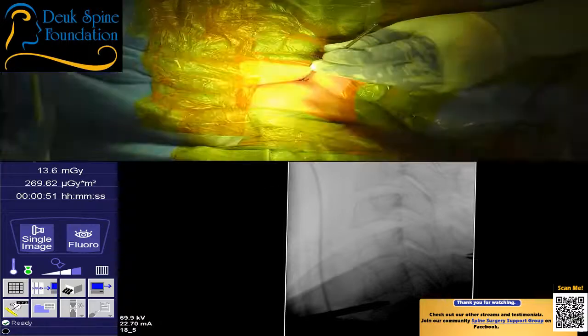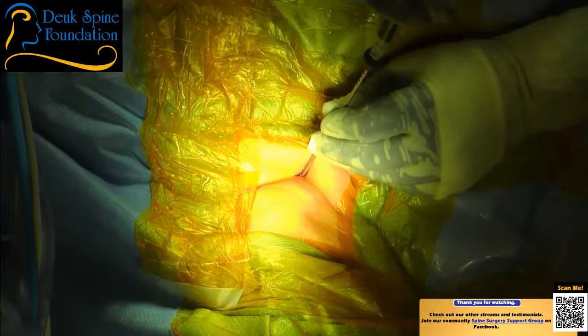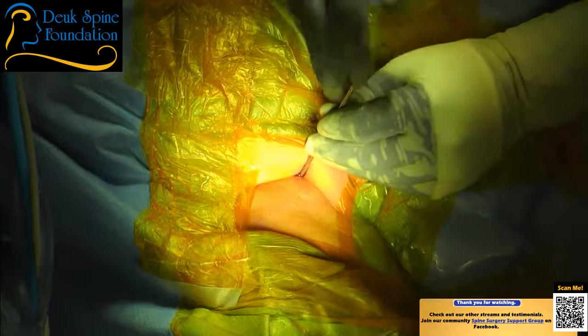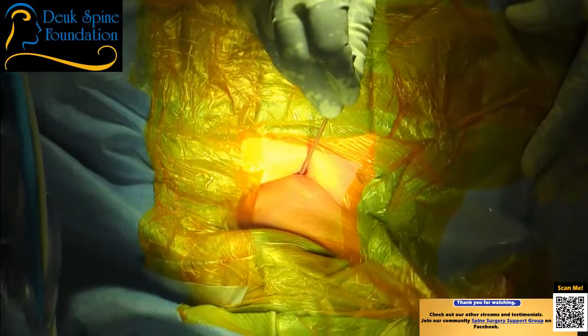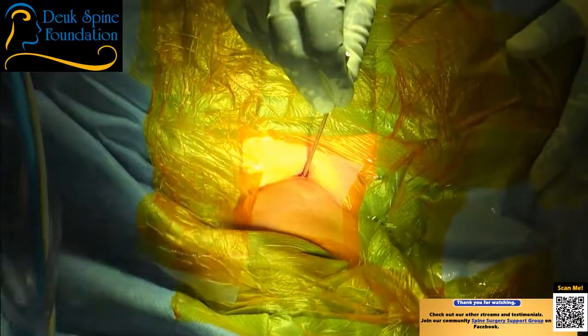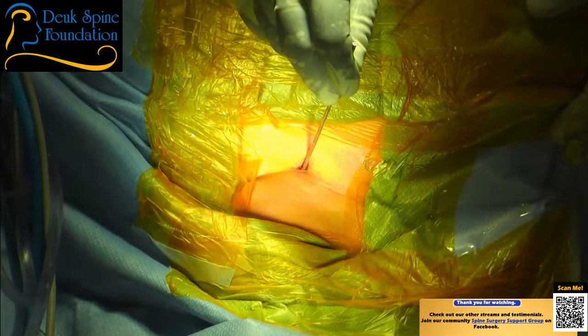I'm going to do my discogram first. All right, now we need a neutral pull first from you and then us. Once you get her locked in position, so she doesn't move south, tell me when you're ready. Ready? Shot. All right, perfect.